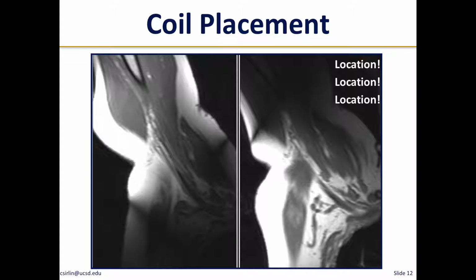We're now at 95% quality simply by doing the right exam, preparing the patient, and putting the coils in the right place. By the way, how often are coils in the wrong place? I would say, I haven't measured this, I should do this. In fact, Sudha, this will be your next study, and you're going to very pleasantly say, Dr. Sirlin, of course, I would love to do this study. We should actually figure out how often coils are not in the optimal place.